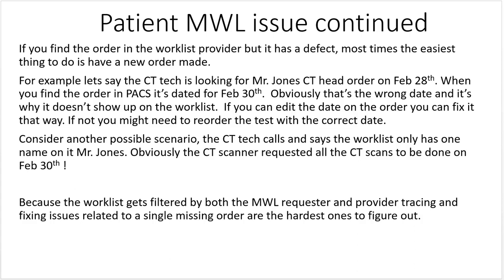Consider another possible scenario. The CT tech calls and says the worklist only has one name on it, Mr. Jones. Obviously, the CT scanner requested all the CT scans to be done on February 30th. Because the worklist gets filtered by both the modality worklist requester and provider, tracing and fixing issues related to a single missing order are the hardest ones to figure out.